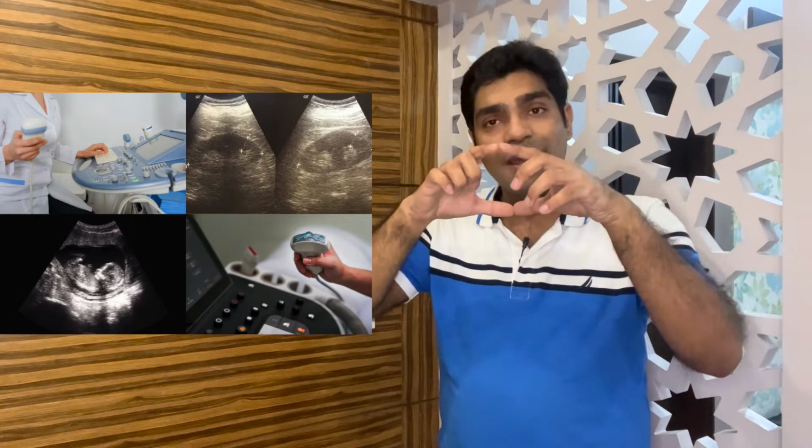This reflection capability is different for different organs. So let us say a doctor is examining the abdomen or your stomach area. Your liver, stomach, every organ will give a different reflection back, and based on that the doctor can analyze, this is liver, this is stomach, this is the gallbladder, because the reflection is different and it appears as a different shadow. The reflection from the gallbladder will be different from the liver, and the shadow of the gallbladder will appear on an ultrasound with that same reflection, while the reflection from the liver gives different imagery.